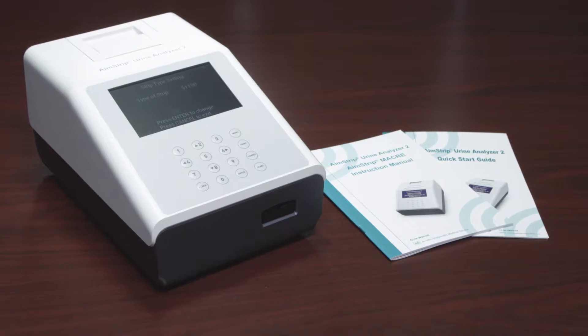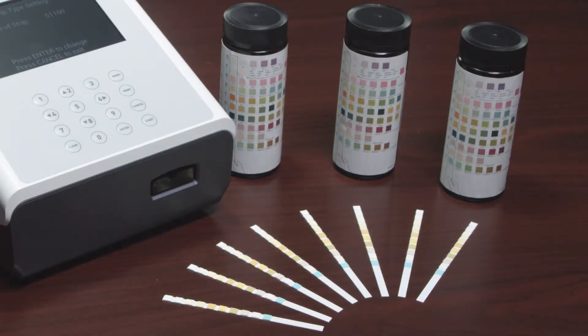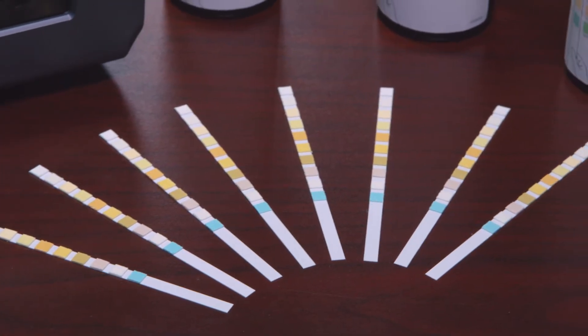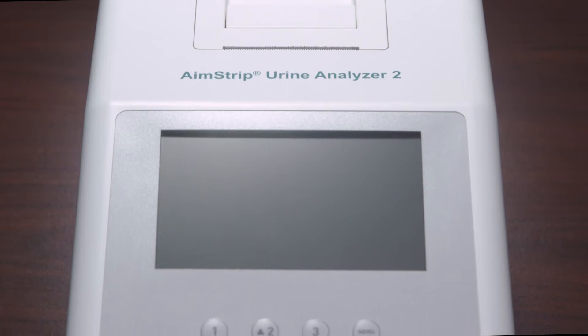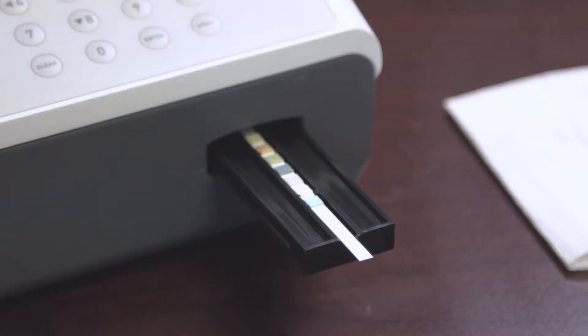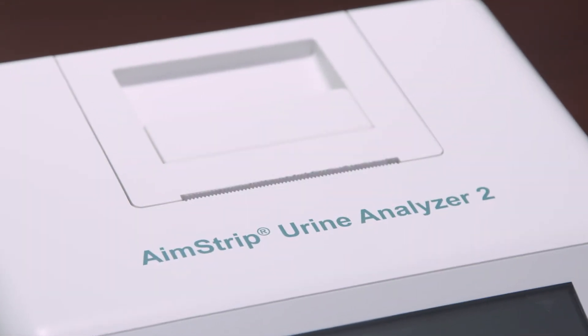The AimStrip Urine Analyzer 2 is a manual reflectance photometer that analyzes the intensity and color of light reflected from the reagent areas of a urinalysis test strip. It is specifically designed for improved accuracy and efficiency and can read up to 120 strips per hour. In this video, we will review the most commonly used features of the AimStrip Urine Analyzer 2.